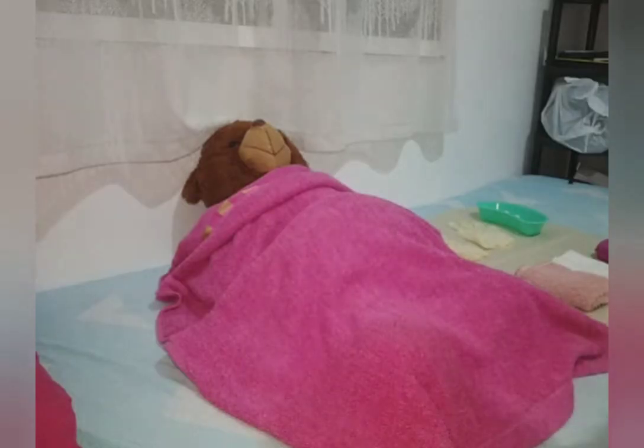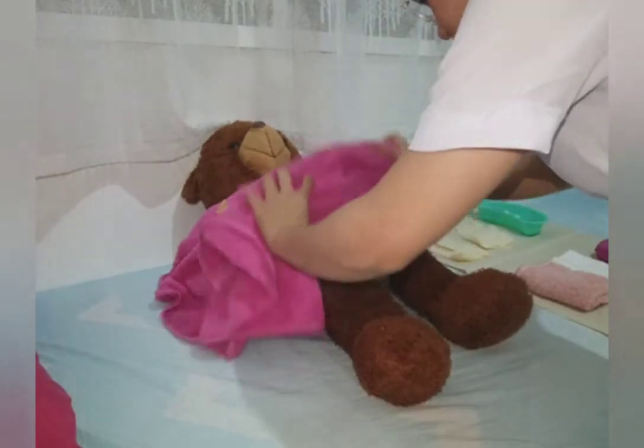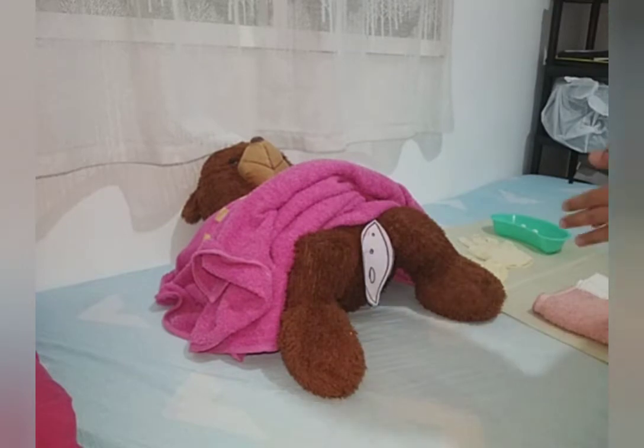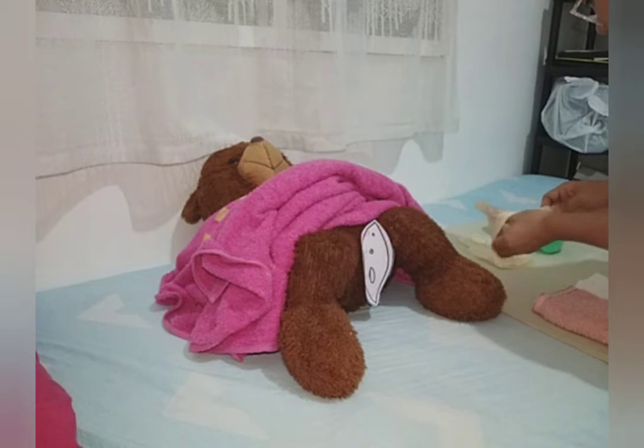For privacy, I will put on the curtains, and we need good lighting to avoid errors, as in the female it is very hard to find the urethra. Now I will position my patient into the dorsal recumbent position with knees flexed and feet flat on the bed. Now I will perform hand hygiene and put on my clean gloves for the perineal care.